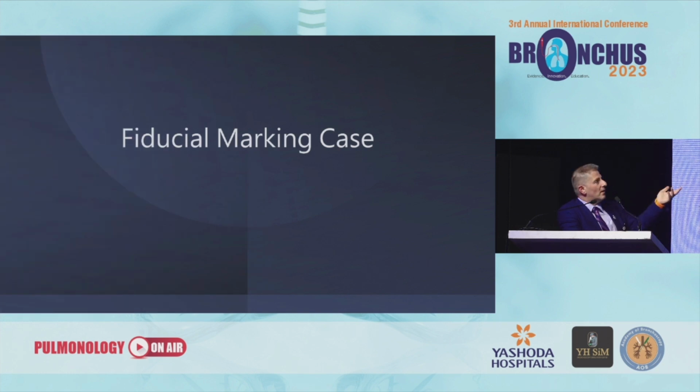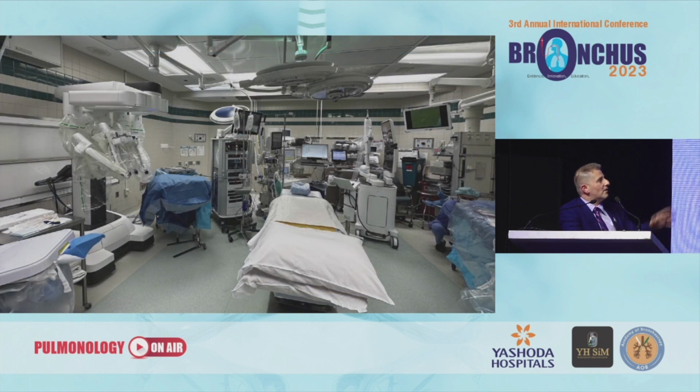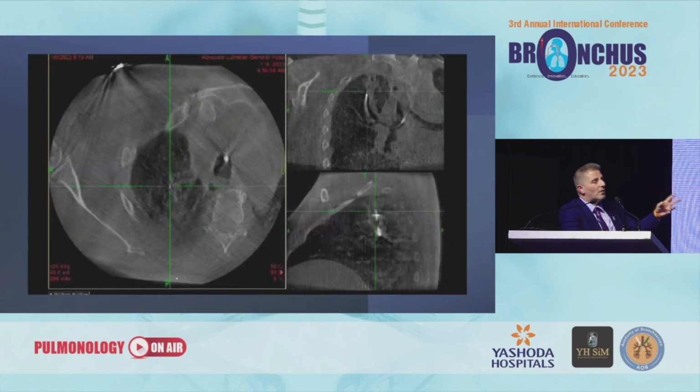And for the last case, also now for more accuracy for the segment removal, combining same-day anesthesia for those cases, which we'll talk about in detail later in the day. Here, a case where you have the Xi da Vinci and the Ion in the same room, starting in the morning first with labeling. You can see here, because of the delayed anesthesia, we created some atelectasis, but our target was more central but more apical.